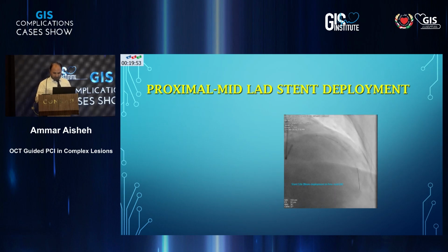But I think just to go back here, using OCT is very important. In this case, it's a very long lesion. You have to understand the type of lesion that you are dealing with and the length. We already have an OCT that proves there is almost subtotal occlusion and multiple areas of disease. There is not much calcium. And with this subtotal occlusion, we already know the size of the stent that we need, and preparation of the vessel before you stent is very important.